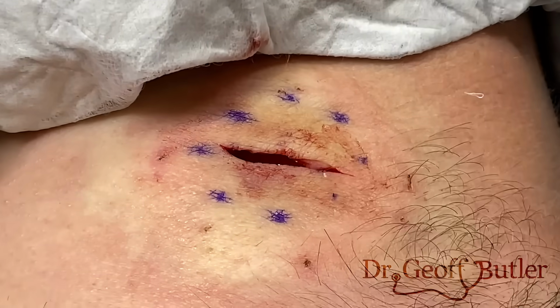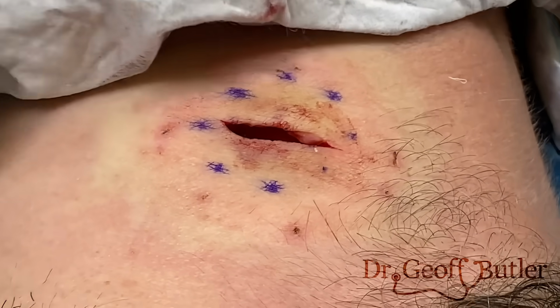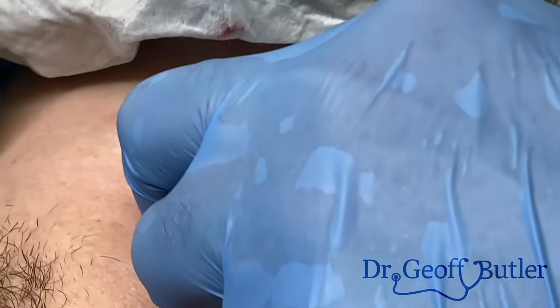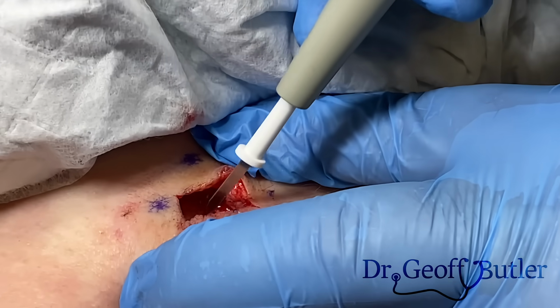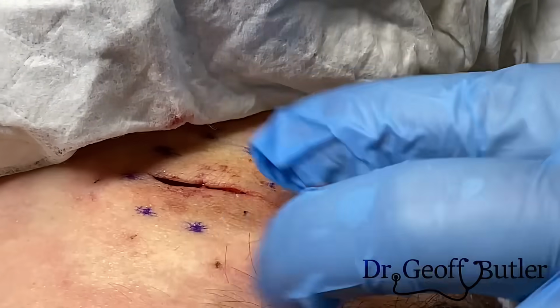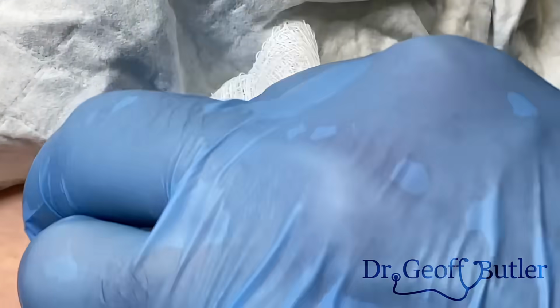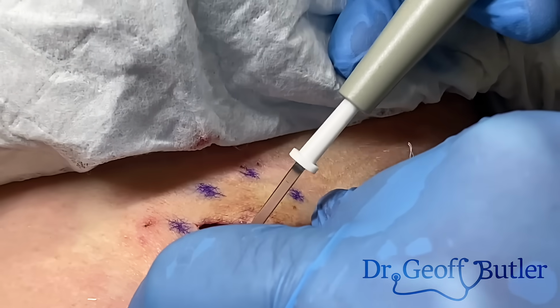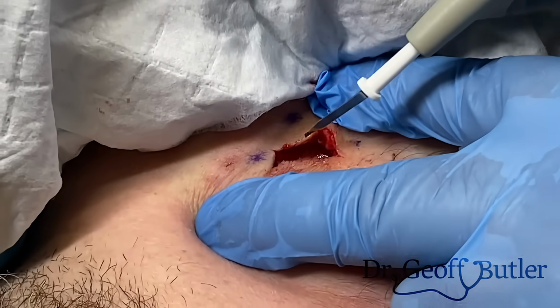But the back part, we want to use a bit of cautery again like that. Pardon me? Yeah, I'll rinse it too. That's a good idea. It's not hurting? Nope. So as an example, like this area here, which I can cauterize, that's going to get caught up in the stitch, so that's going to be tamponaded no matter what we end up doing. It's just the underlying stuff that we want to make sure if we can get a little bit. And oozing's not a big issue, so I don't mind if the wound bed's a little bit.